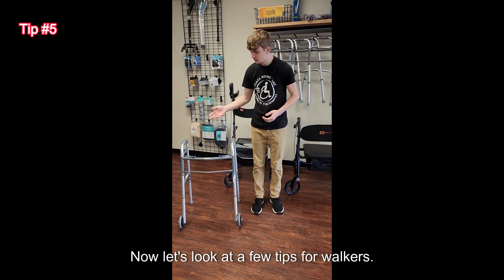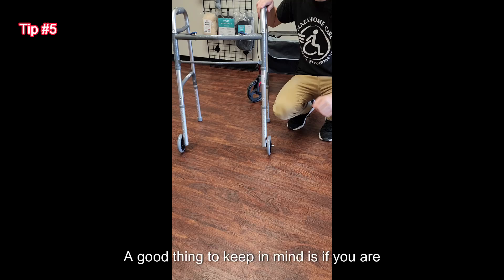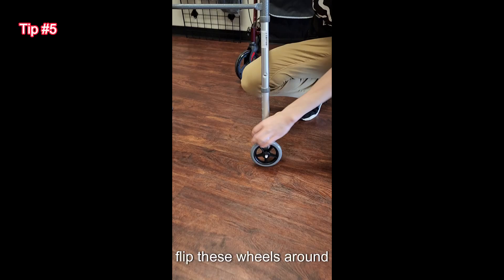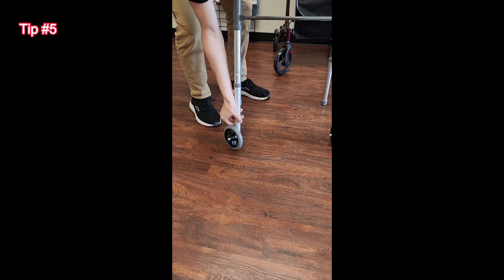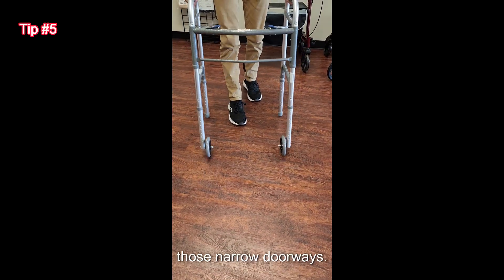Now let's look at a few tips for walkers. A good thing to keep in mind is if you are struggling to get in and out of doorways in your home, you can flip these wheels around on either side, which will make your walker slightly more narrow so you can traverse those narrow doorways.